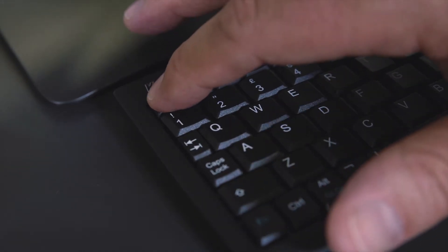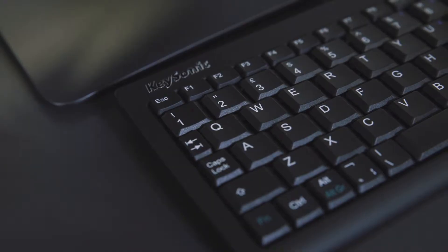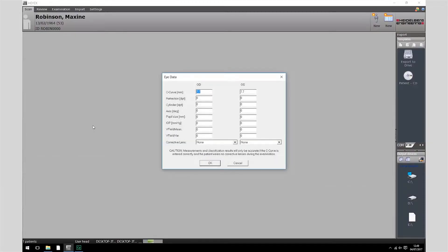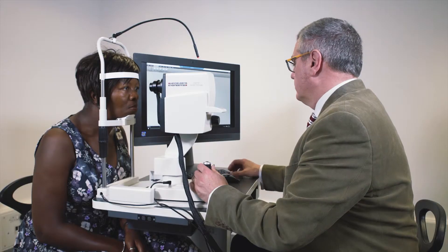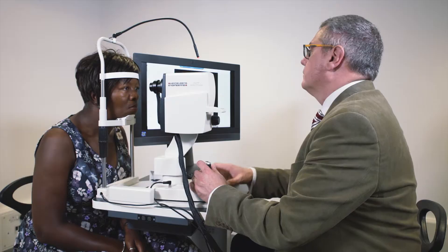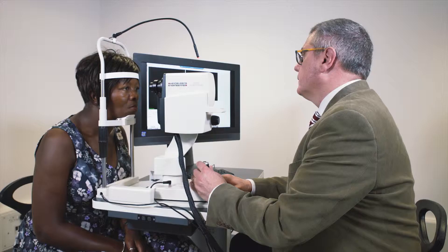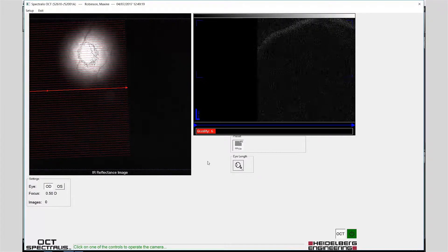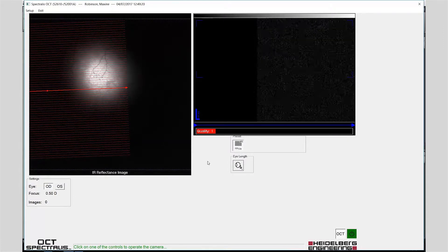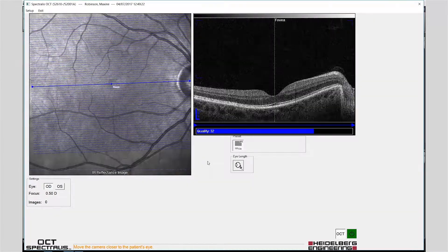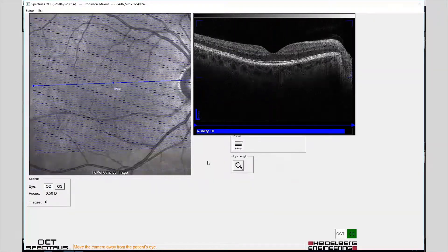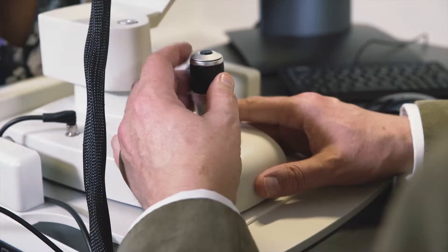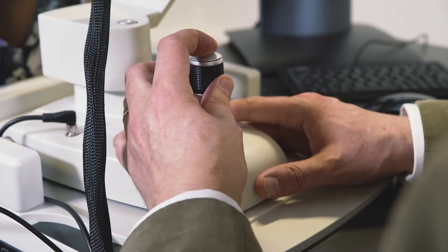Press Escape to continue to the retina examination. Once again align the fundus image until evenly illuminated and the scan pattern has changed from red to blue. Begin image acquisition with a single press of the joystick button.